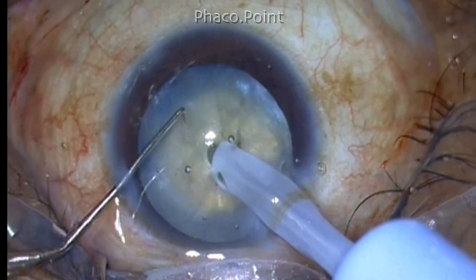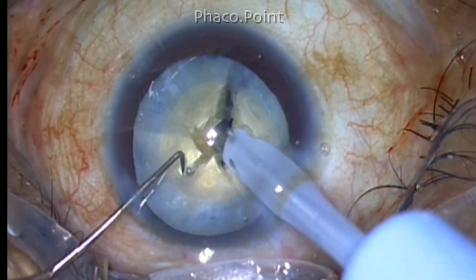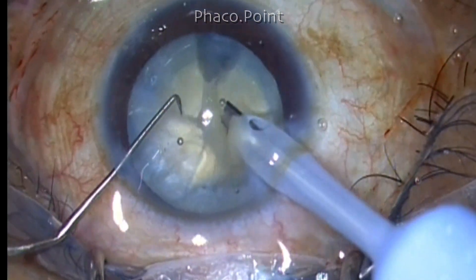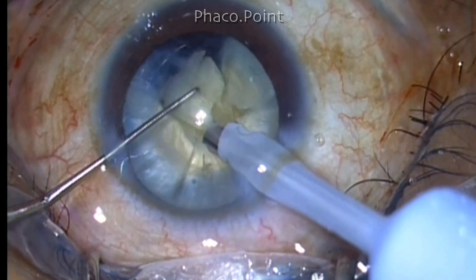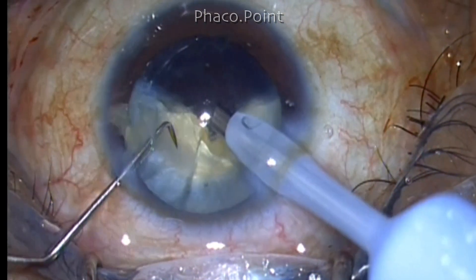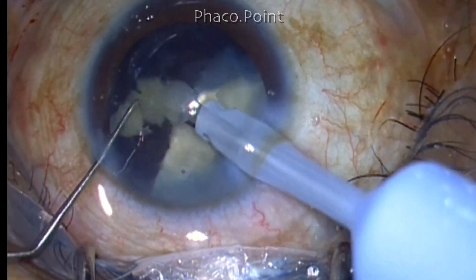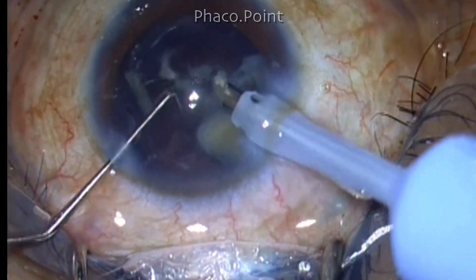As you can see I'm creating multiple small fragments — at least six multiple small fragments are created. I'm creating the lateral separation and making sure that the crack has gone through and through. At this point the nucleus has been completely fragmented and you can proceed with the fragment removal. The mobilization of the fragment is carried out using a vacuum setting of 300 to 350 millimeters of mercury. I'm using the multiburse mode and a phaco power of just 40%. In the Venturi machine the vacuum is able to draw out the fragments to the center and by giving small bursts of phacoemulsification you are able to quite easily get rid of these fragments in a very predictable, safe, and reliable fashion.